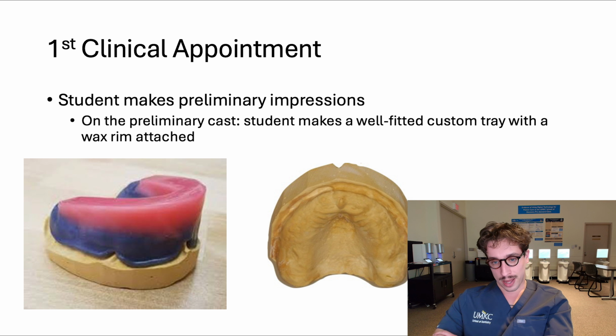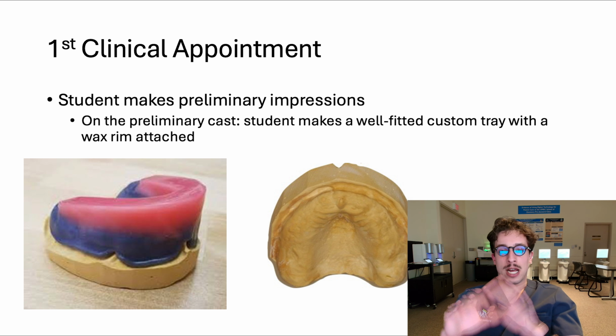And so let's go ahead and dive a little bit deeper into each of these clinical appointments so we can have a better understanding of what they entail. So that first clinical appointment, this is an example of a wax rim that's fabricated on top of the custom tray. I know it feels weird to do. Just don't overthink this part.